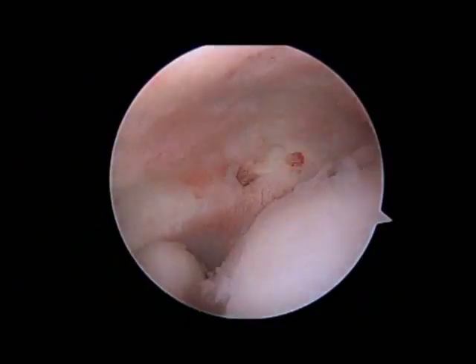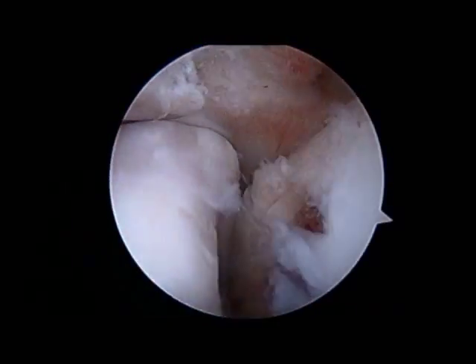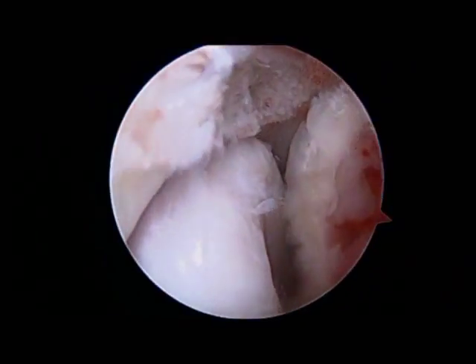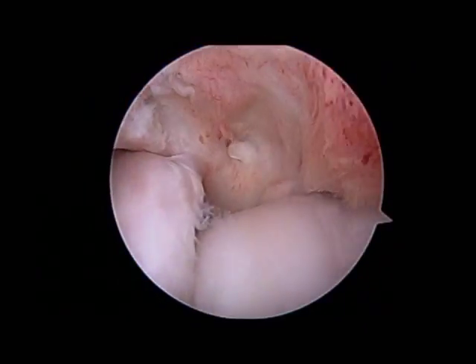Once that's done, you can see the OCD lesion again down below. As the elbow is moved around, the radial head does not fall into that hole, and there should be good potential for that to heal.